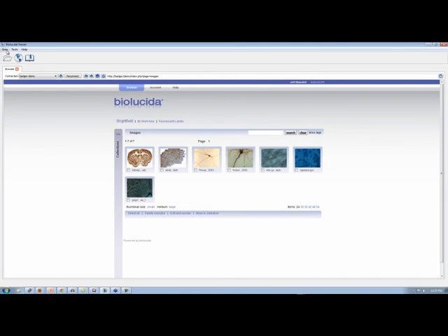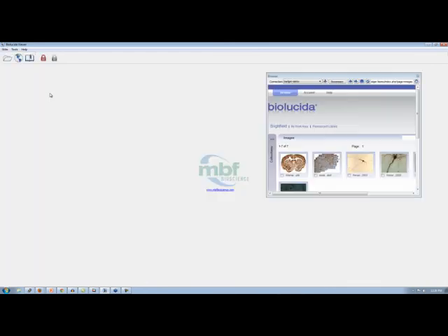We're going to go up in the upper left-hand corner to slide. And if you go down to slide, we have a layouts option. In the layouts option, the top option is tabs, and that's what we've been using so far, where every image you open opens up as its own tab. We also have single, 2, 3, and 4 image views, which are comparison views. So let's select the 4 image view.